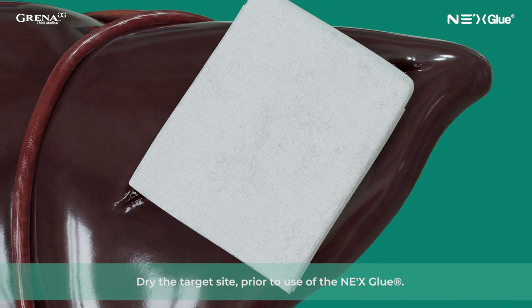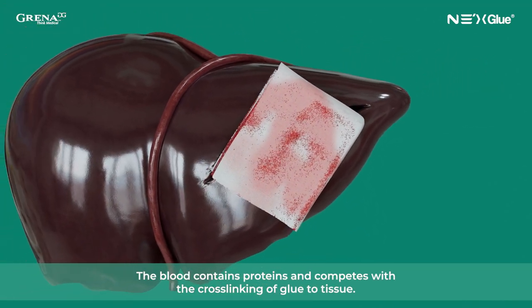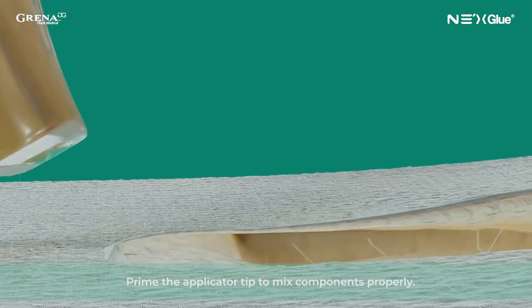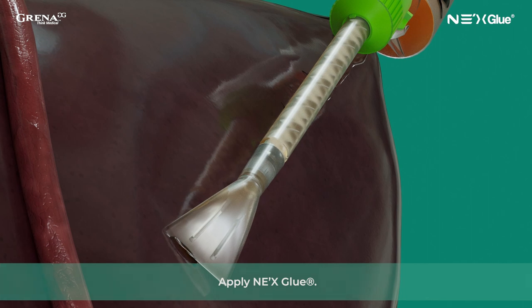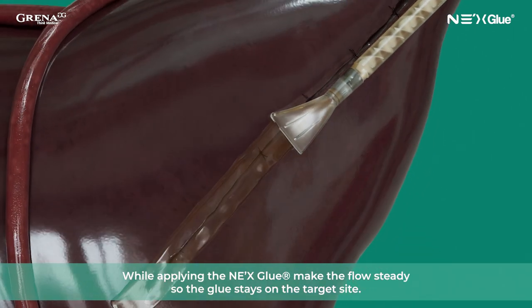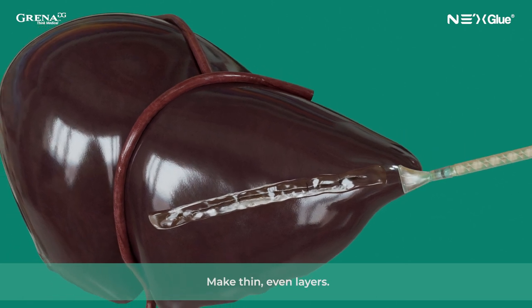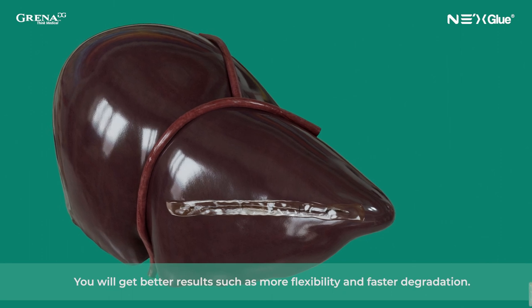Dry the target site prior to the use of NexGlue. The blood contains proteins and competes with the cross-linking of glue to tissue. Prime the applicator tip to mix components properly, then apply NexGlue. While applying, make the flow steady so the glue stays on the target site. During the application, the main rule is less is better — make thin, even layers. You will get better results such as more flexibility and faster degradation.